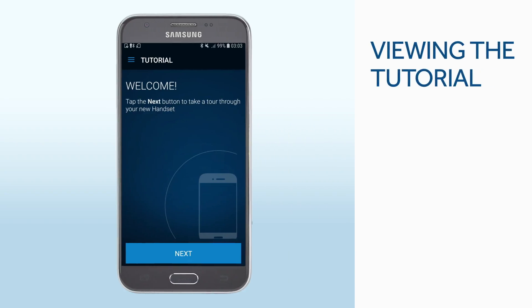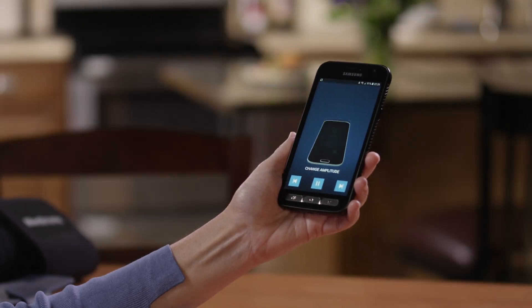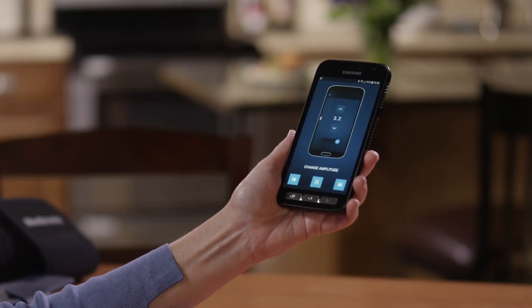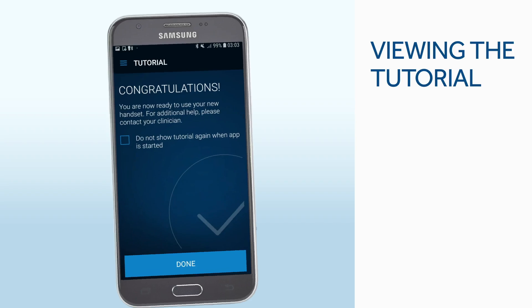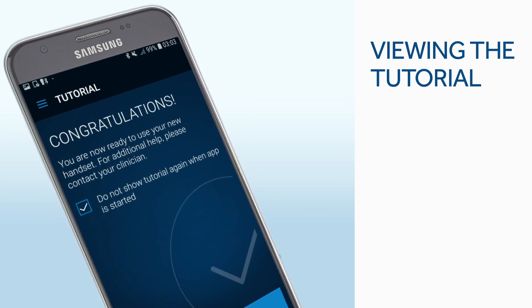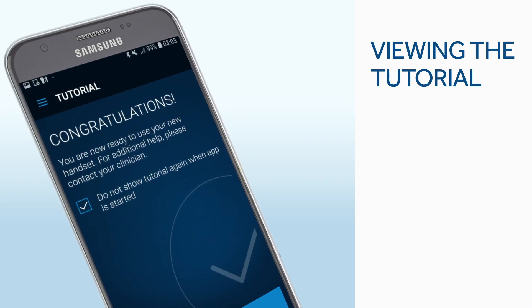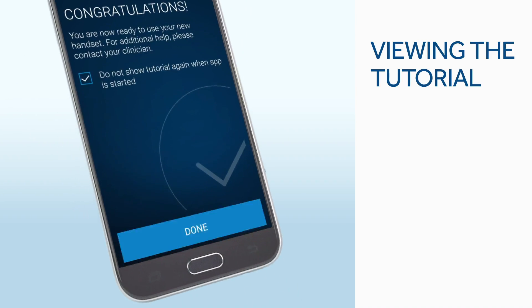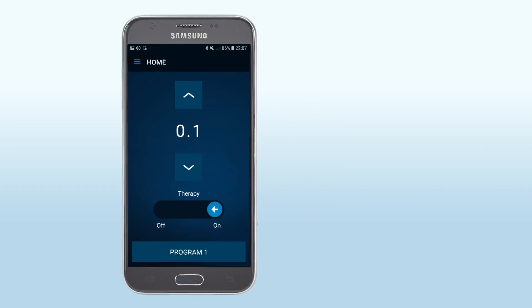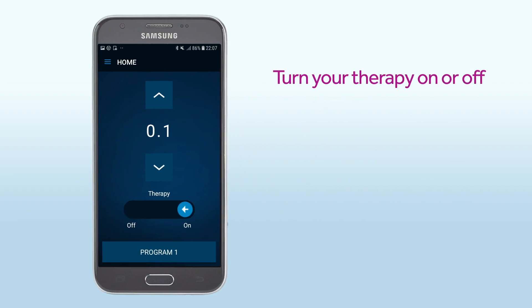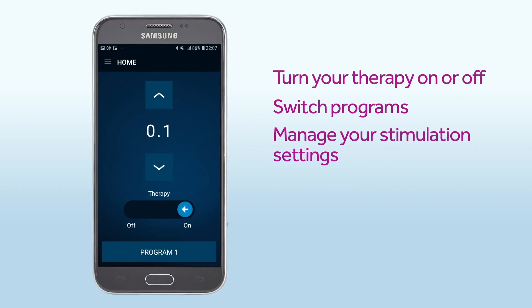The first time you use your smart programmer, the tutorial plays. Tap Next to begin the tour and scroll forward to advance. It is not necessary to view it each time you access the app. You will have the option to tap Do Not Show Tutorial Again at the end. Tap Done. Adjustments to your therapy are made on this screen. You can use your smart programmer to turn your therapy on or off, switch programs, or manage your stimulation settings.